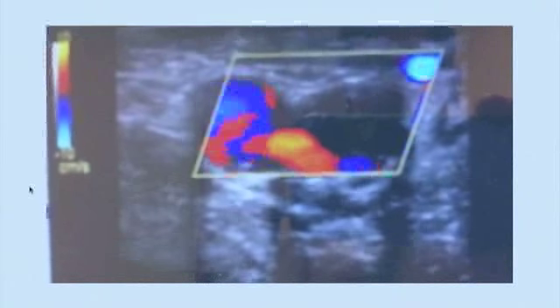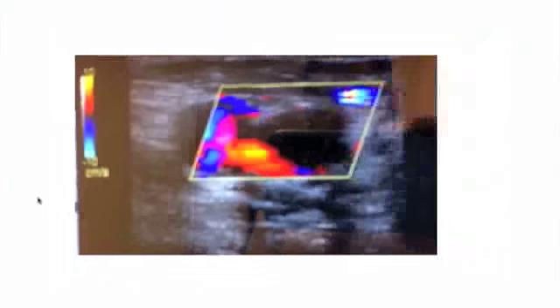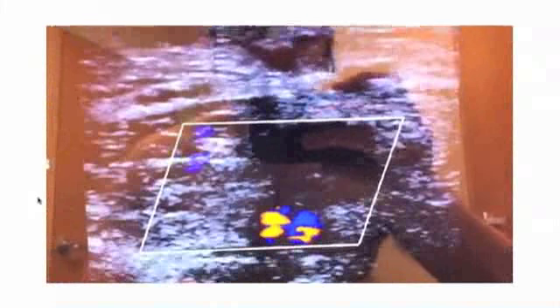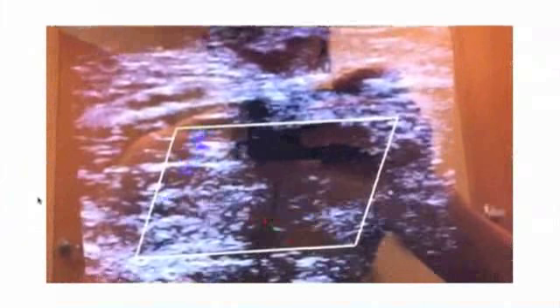So the vein should compress before the artery. Correct. Okay. That is a true statement. Now, what about this one? We just saw this, and it looks like they still have a clot. I just told you they did, so we'll move on to the next one. What about this? You got a pulsatile artery, good flow. You see anything in the vein? I see no flow. This is not a compression study, but this is just another example of color flow and how you will not get any through the vein if it's completely occluded.